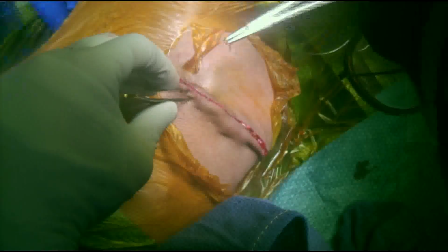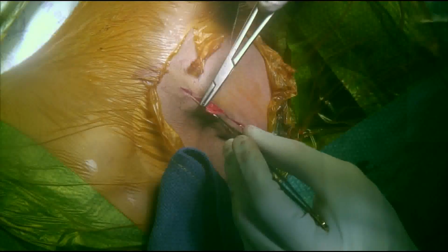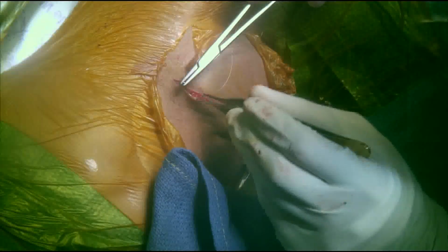Refilling of the pump is a simple and straightforward outpatient procedure that can be done usually with the presence of the pediatric neurologist along with the caretaker or parent, and usually a company representative who is also going to check on the pump and program the new settings for refilling.